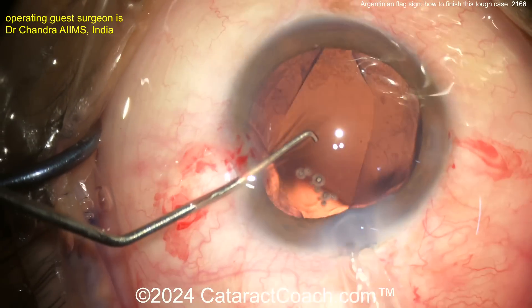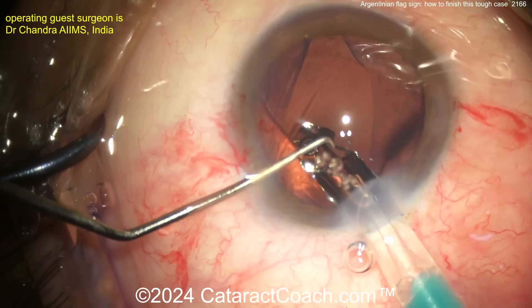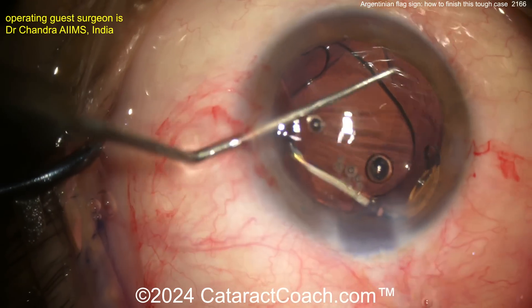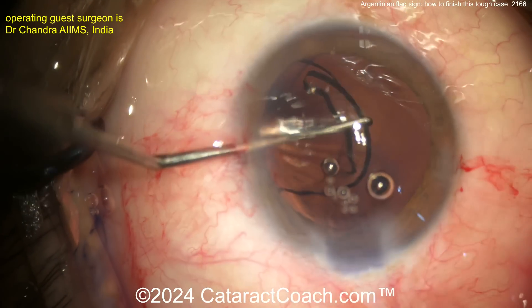Here comes the lens. It looks like a single-piece acrylic. Let's get that in the bag. Get those haptics 90 degrees away — on your screen, I want the haptics horizontally. Getting it in there — nice and easy, nicely done. Get that haptic pulled in and under the rhexis.